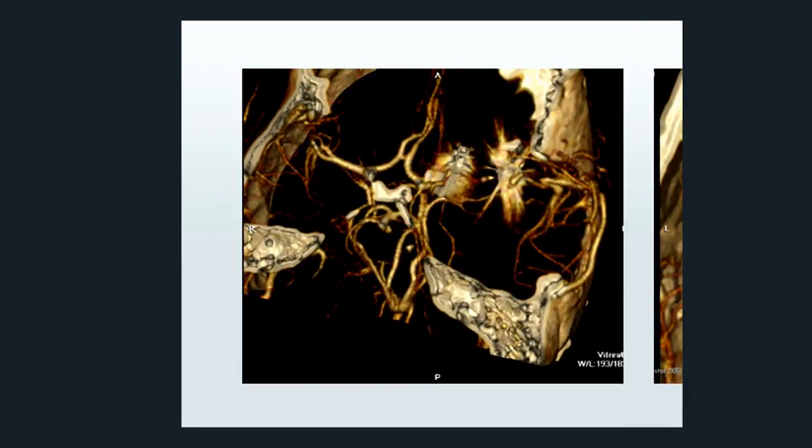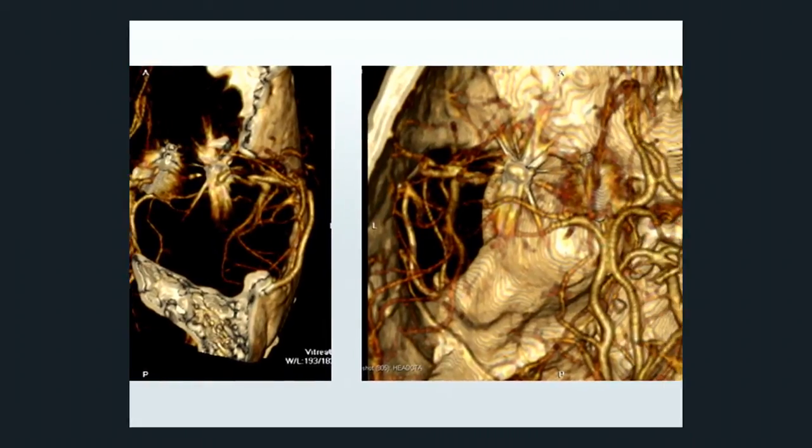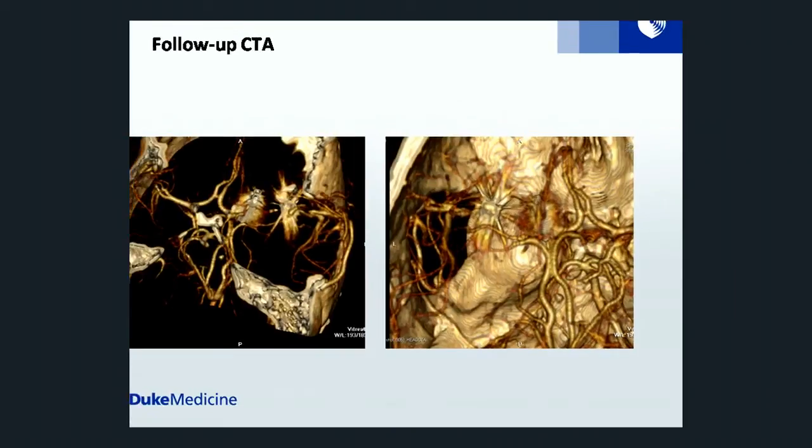So you can see the two branches going in here, and you can see here they come in and they reconstitute those two big blood vessels that were coming out of this aneurysm. And once you do that, then you can just put a clip proximal to the aneurysm so no more blood can get into it. So you bypass, keep nutrition going to the brain, and get rid of the aneurysm. And she actually went to her prom 2 months after this surgery, which was a real big deal for me.